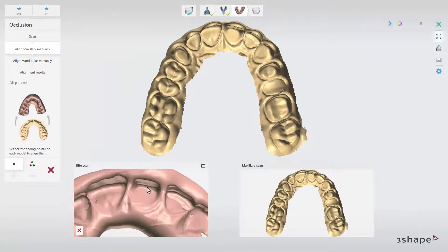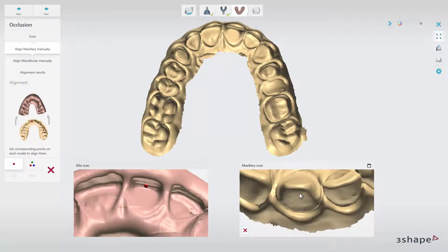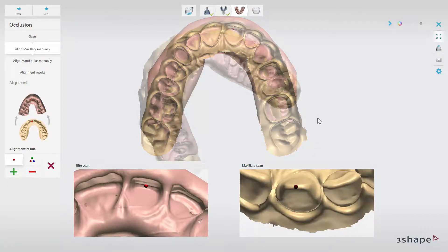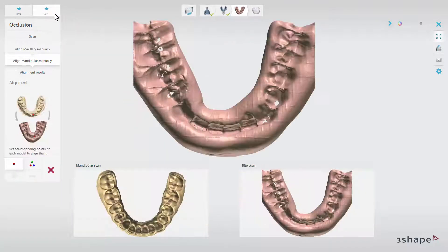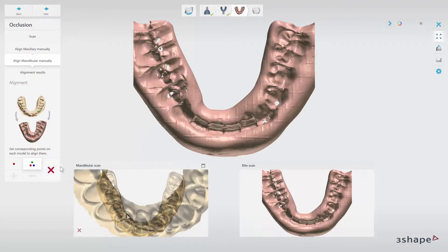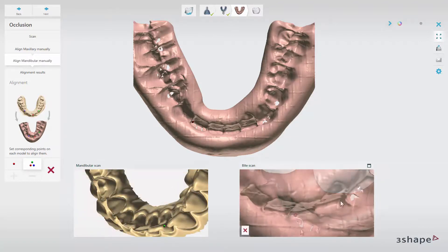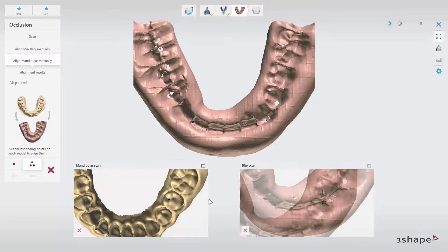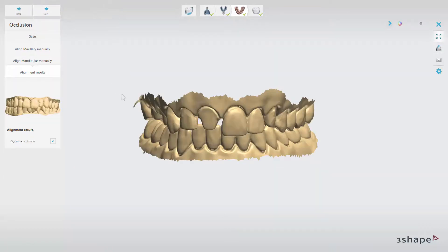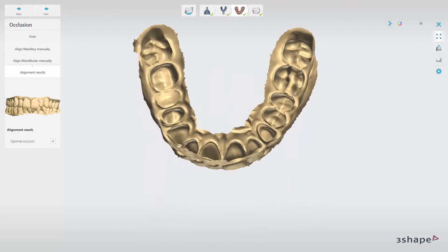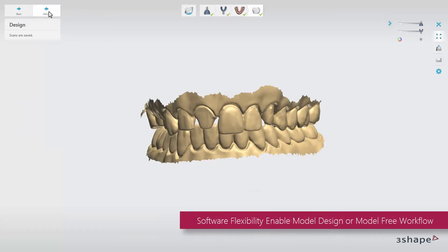You can do the alignment manually using one or three-point alignment. One-point alignment is the default option. Place a point on the bite impression scan and then in the corresponding place on the upper jaw scan — the scans will align. Then click Next and do the same for the lower jaw scan. When ready, click Next to go to the alignment results and see the scans in occlusion. If any small discrepancies occur, use the Optimize Occlusion tool for better calculation. When you click Next, your scans will be saved and you can click Design to move to Dental Designer.